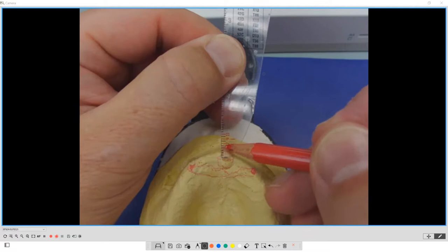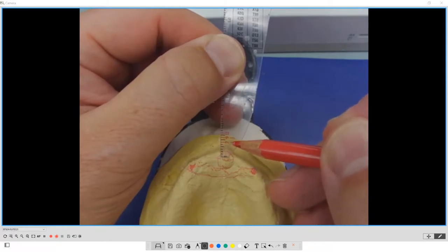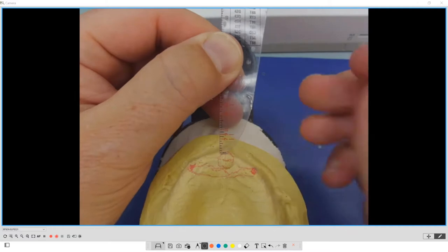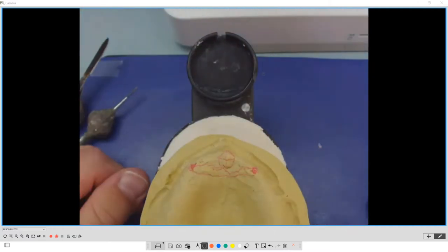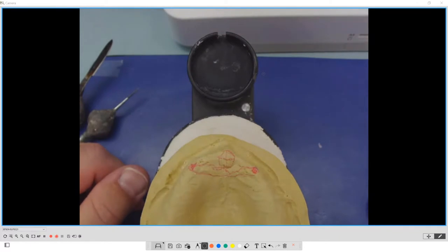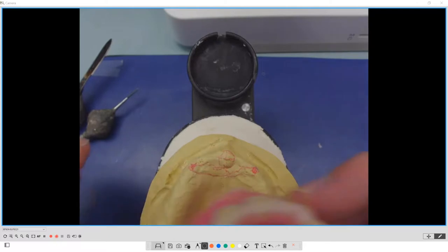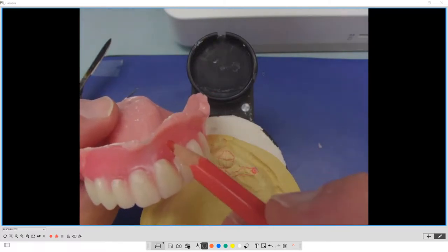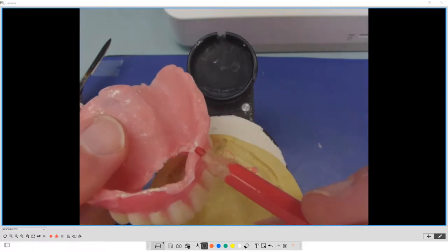Okay, is where our incisal edge, we're targeting the incisal edge somewhere in this area. 7 usually puts us on or just behind the wet and dry line, and 9 will kind of go on the front of the wet and dry line. Now, why is that a big deal? The wet and dry line of the lower lip, pardon me, because sometimes we want more anterior support or we want more lip support for the upper, but then we typically have to bulk out the anterior flange, and now this thing becomes really bulky, but it stretches out the lip, but it also stretches out the sulcus, and then all of a sudden we're getting sores in there.